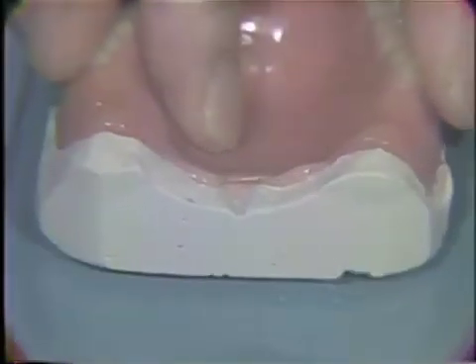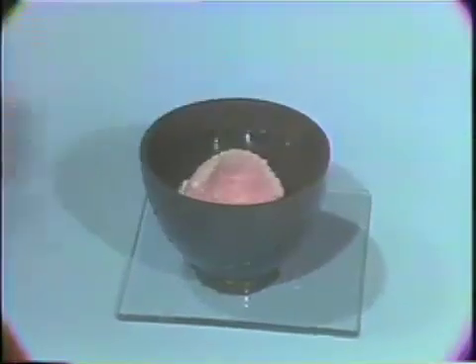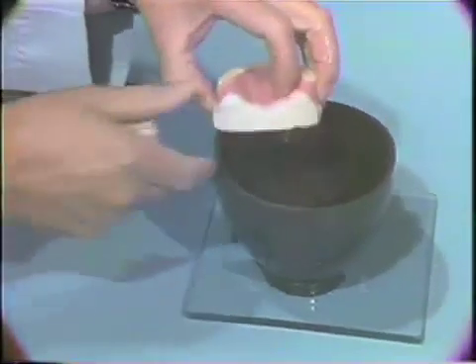After the acrylic resin has reached the doughy stage, place the denture and cast in a rubber bowl of lukewarm water for about 10 to 15 minutes. After the acrylic resin is hardened, remove the denture from the cast.